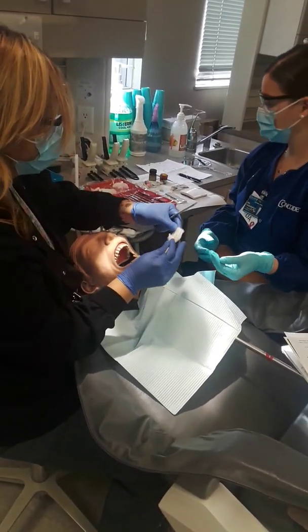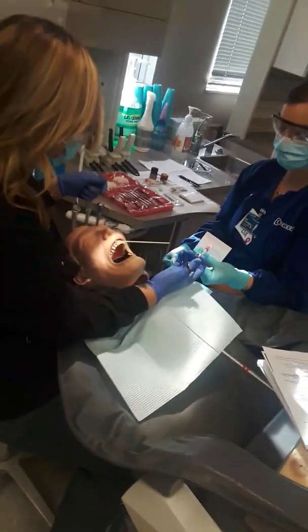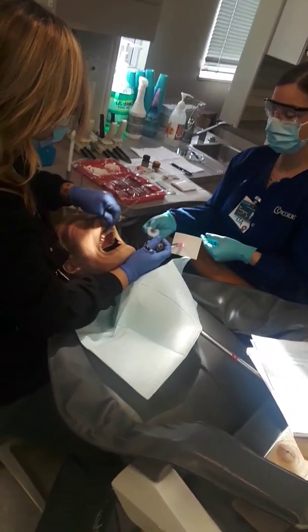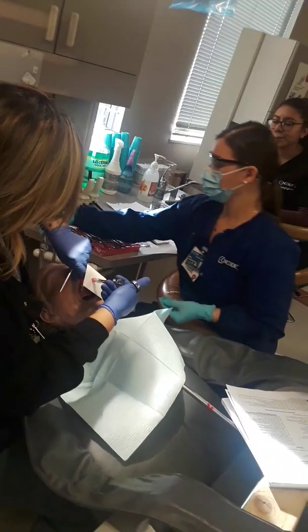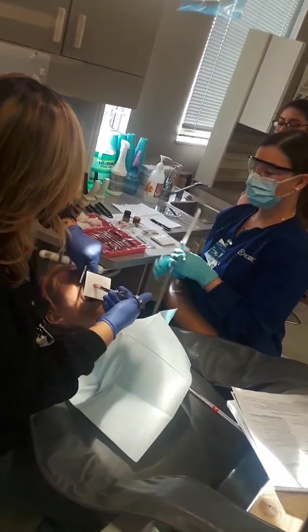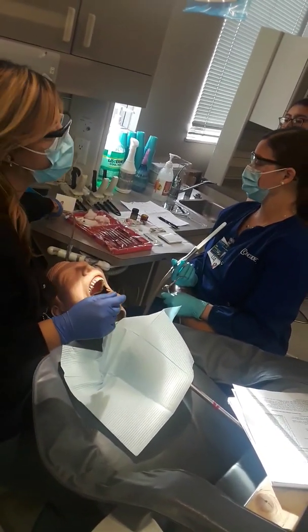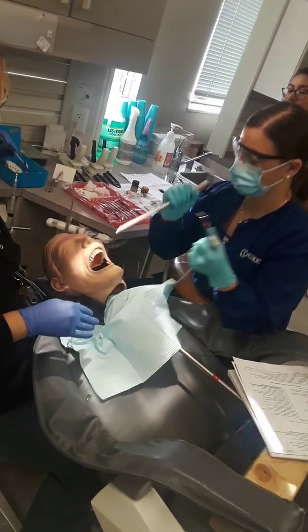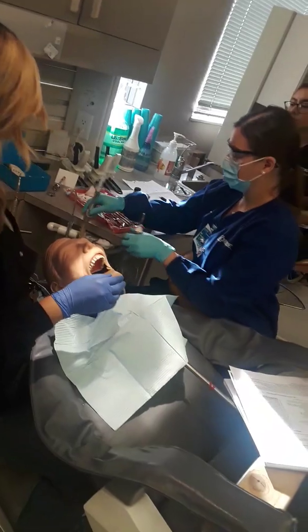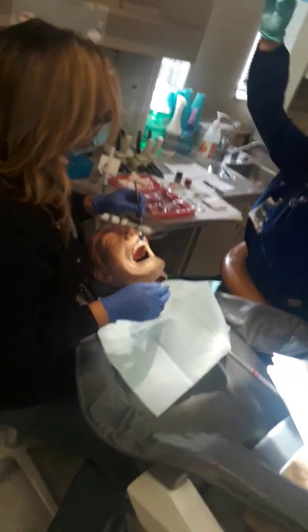Okay, that's better. Gauze to wipe the gingiva, make it dry from my topical layer. She puts the ring on my thumb and my fingers until I grab it. All right, getting patient numb. I don't remove the cap because there's less chance of getting poked while we're just working and practicing. Do a rinse because that medicine tastes horrible. And we have topical gel and it probably doesn't taste like strawberries either.